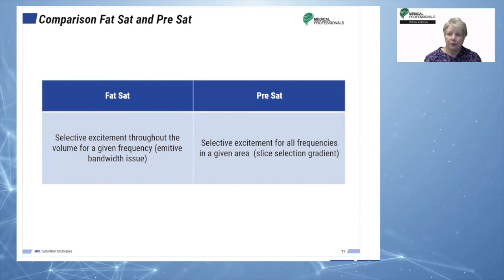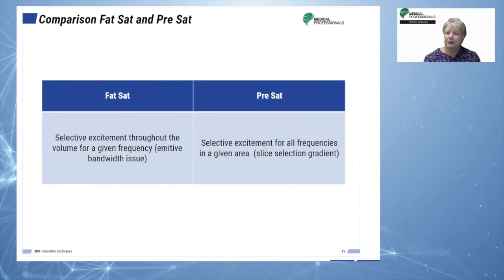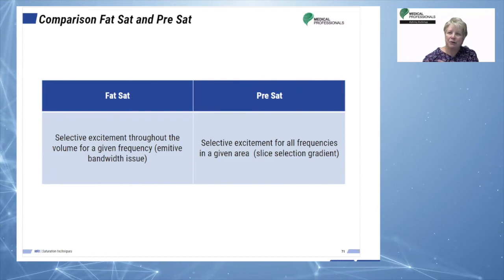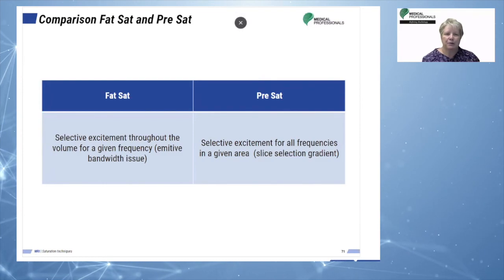Are they useful to saturate water, to saturate fluid? No, they have very specific uses. Most of it has to do with, I don't want to see this in my image, and I want to suppress what's causing it, and use of the saturation pulses will be able to do that.